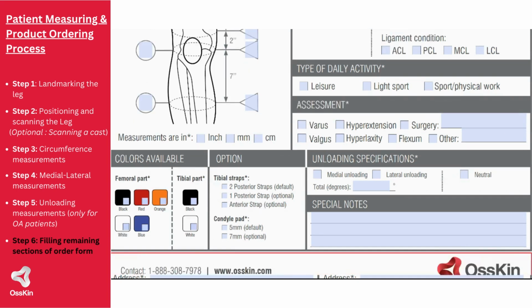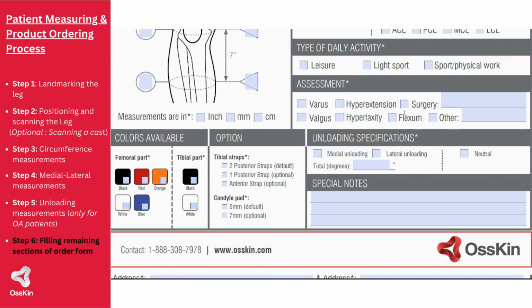We then go into the assessment of the knee. So it's important that you assess the position of the knee as we described in the static knee assessment. Does this patient have a varus or a valgus knee position? If they have any hyperextension, please identify it. Again, staying in the parameters identified for the Evoke or Provoke, so below 5 degrees of hyperextension.